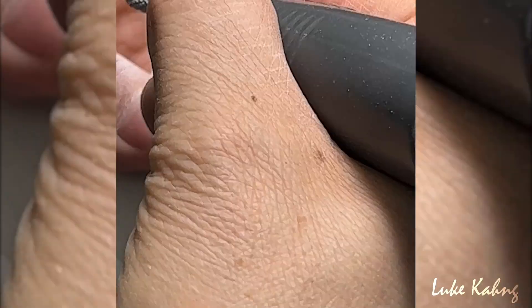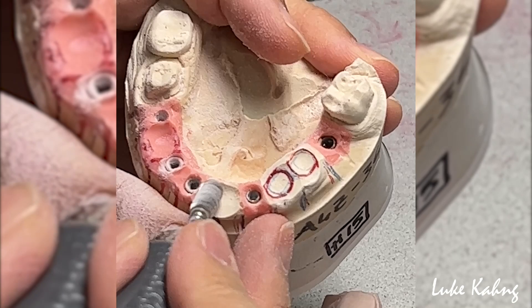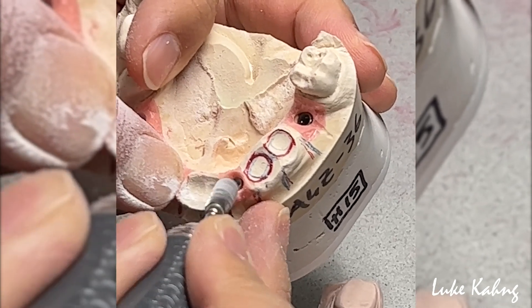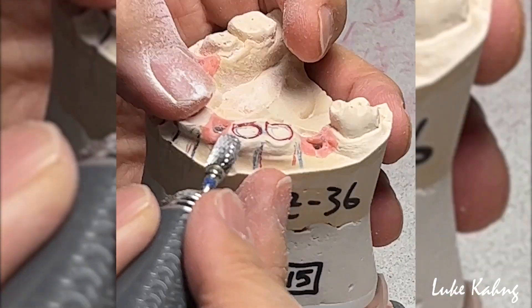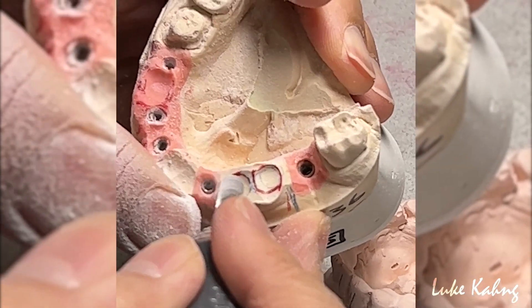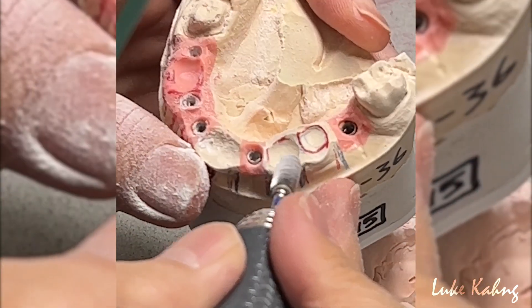I'm going to make a football shape, or even knock out the tools. So I can make a football shape. I'm about to go to grinding, but actually what I do is around here — give it a taste. Same shape and control.